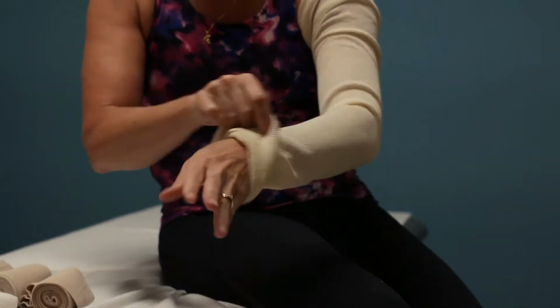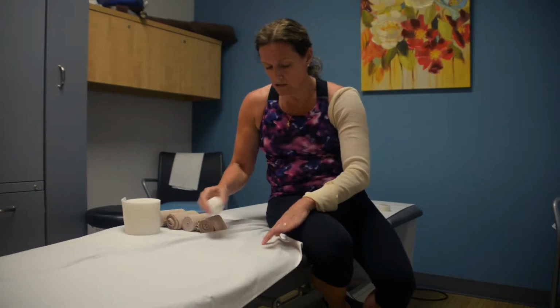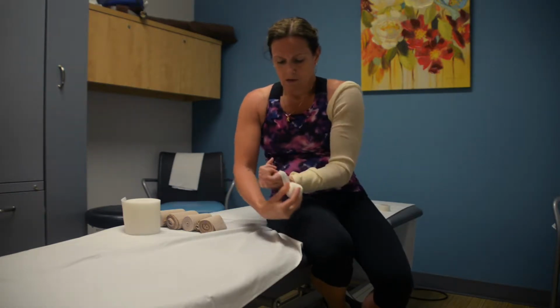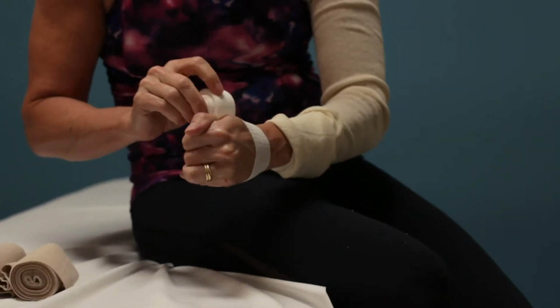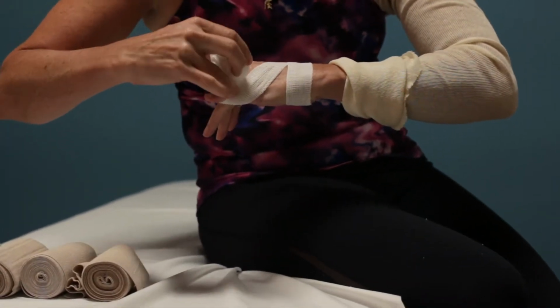And then you're going to pull the stockinette back. Sometimes you'll have to do some finger bandaging, sometimes you don't. But this is your finger bandage, and how you start this is you're going to hold the bandage against your thumb. You're going to go once around the base of your hand. You're going to spiral up, and you're going to do either your pinky first or your thumb first.